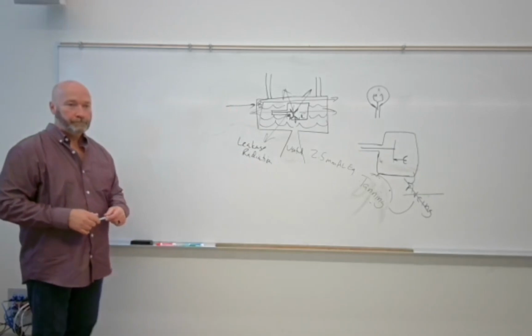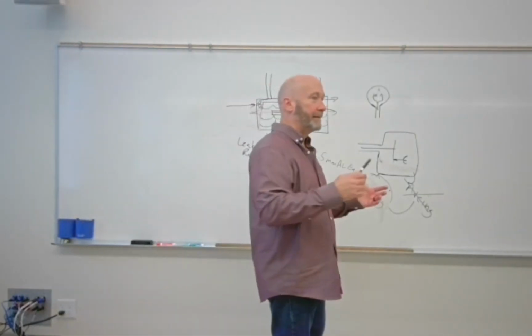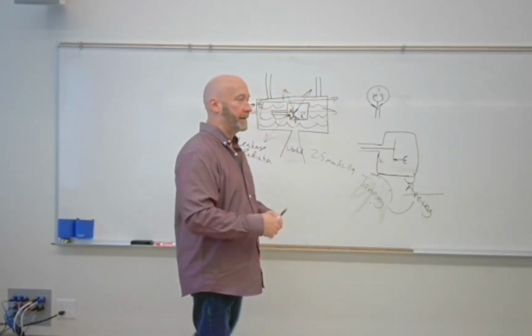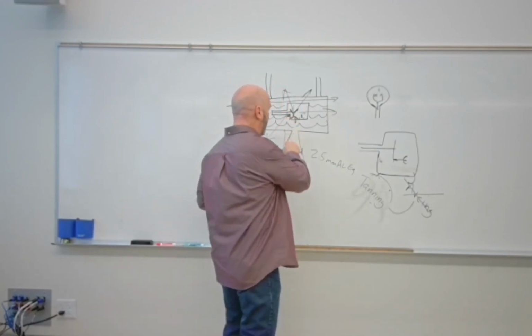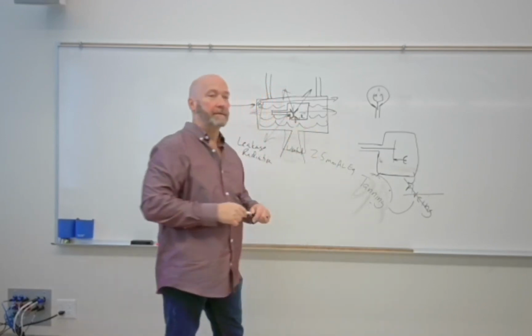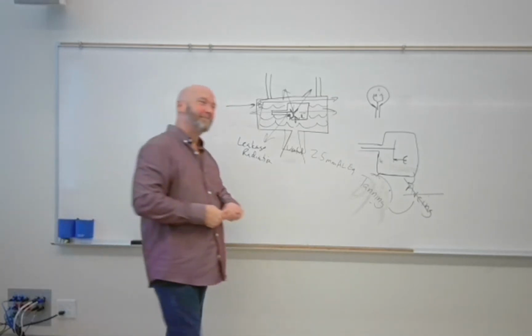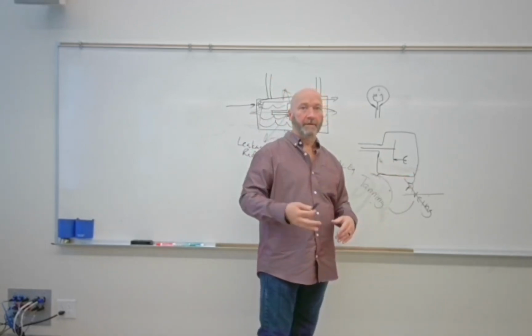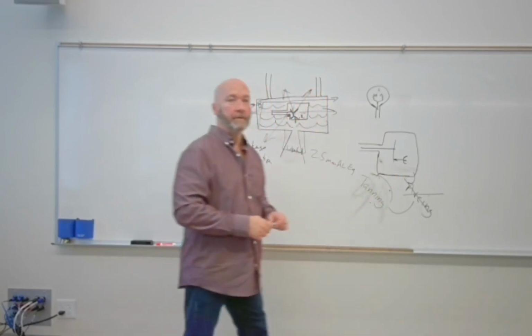So added inherent is just tanning? Yeah, that's the only thing that's going to be an added inherent, is tanning. Everything that you add below the collimator housing is truly added, just added. So you may see it, and a test question is increased inherent, or it adds inherent. Okay.